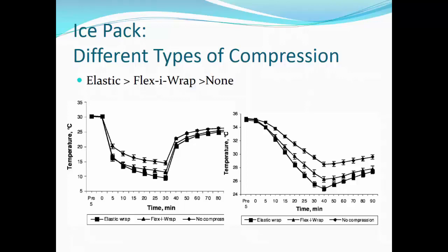Flexi wrap, on the other hand, is single-use, disposable, and cheap, but also results in significant decreases in tissue temperature as a compression device. Therefore, it remains the compression option of many clinicians, especially if they're leaving the clinic for treatment.